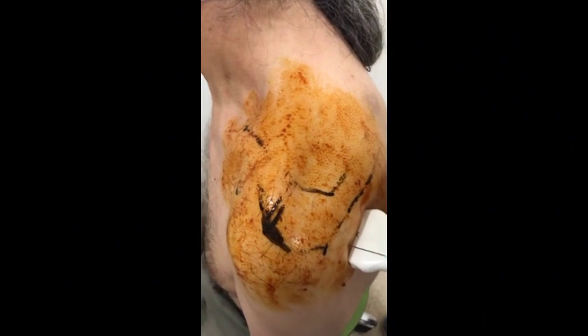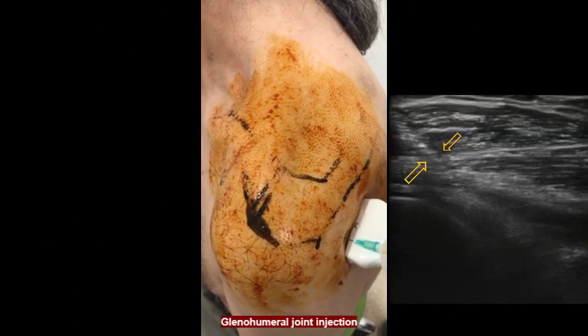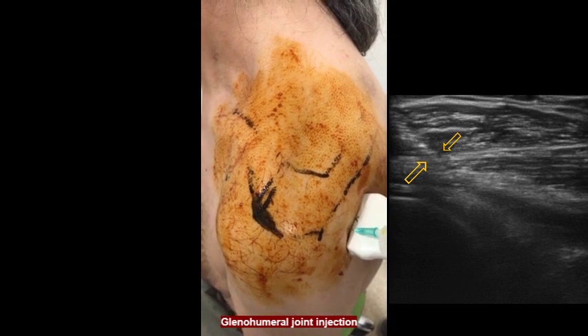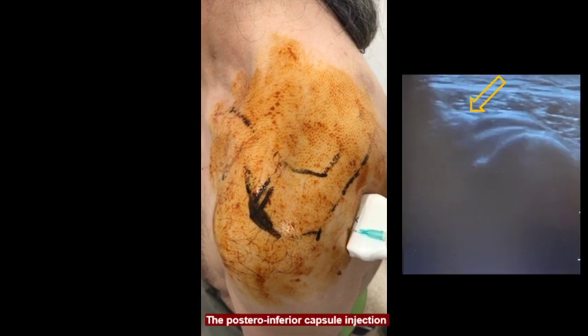The needle is advanced under real-time ultrasound guidance until the needle tip enters the glenohumeral joint. Here, 5 ml of the solution is injected into the glenohumeral joint.